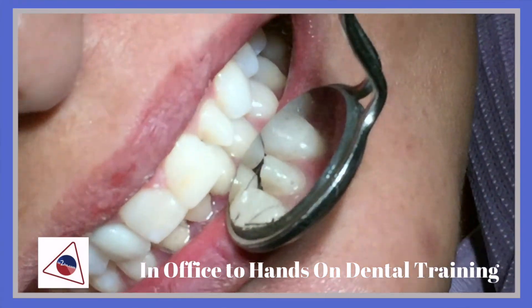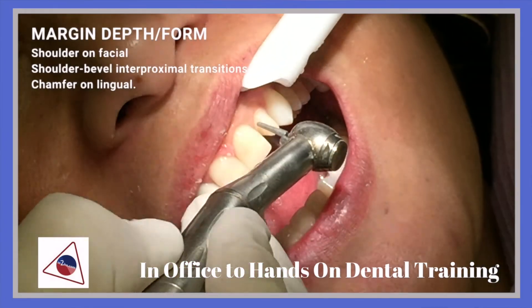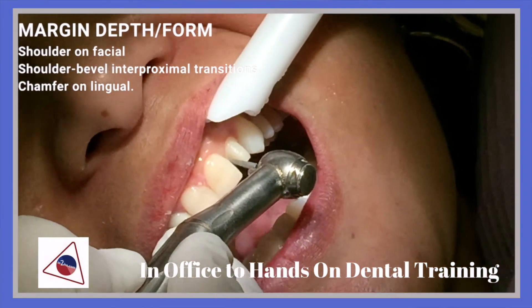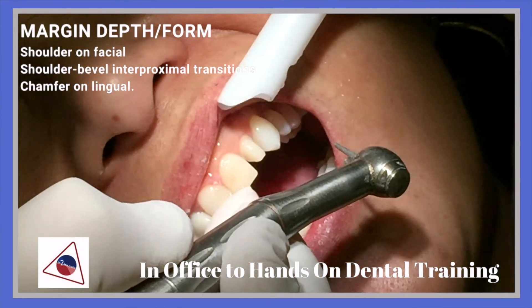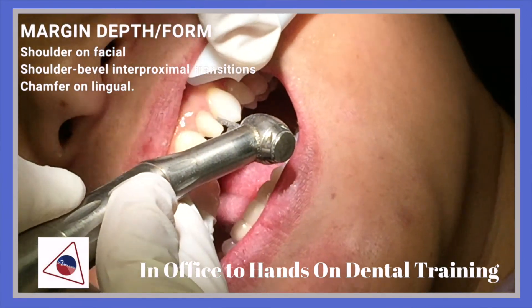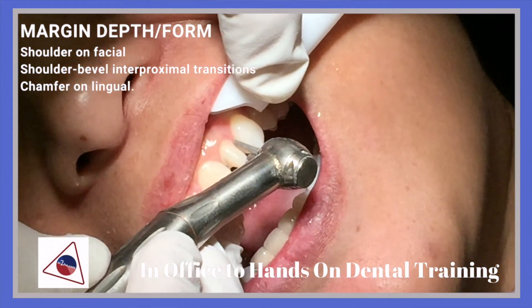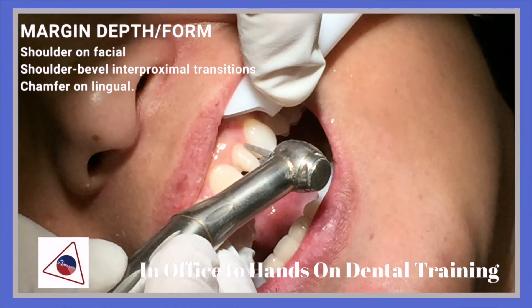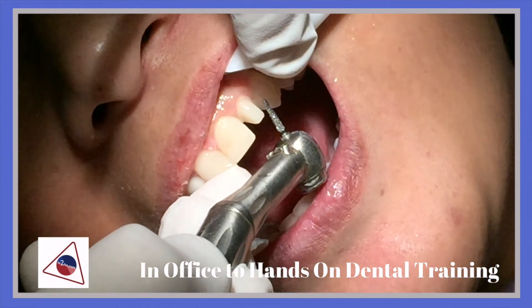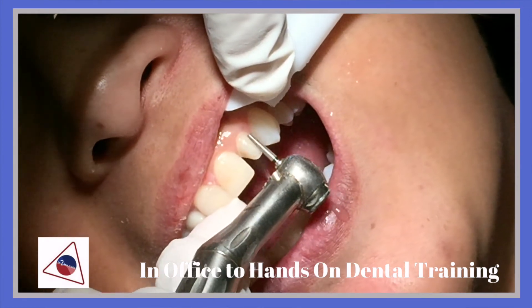You'll notice that there's a lot more room and clearance from the lower teeth. By the marginal depth and form, the shoulder on the facial would be the marginal depth and form, the shoulder bevel in the proximal transitioning to a chamfer on the lingual margin. We are making sure that the transition from the buccal margin to the proximal and to the lingual margin are nice and smooth, along with the buccal surface.